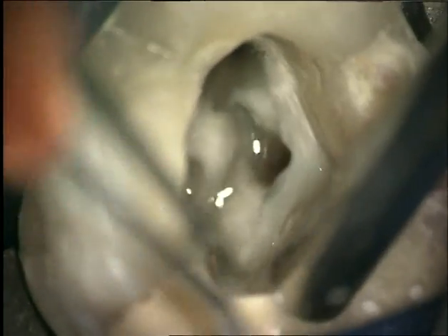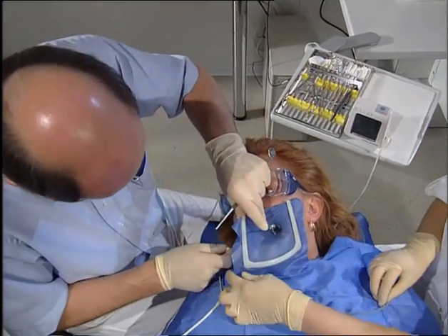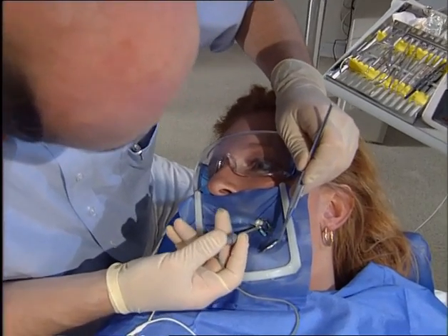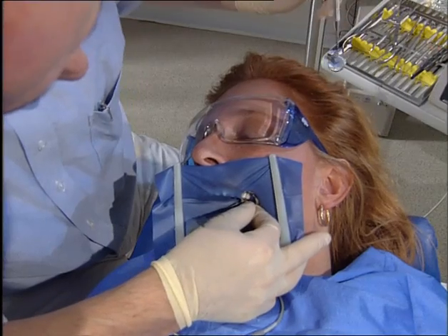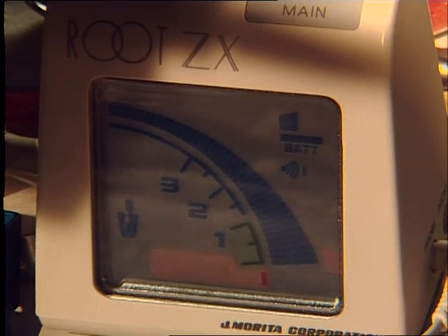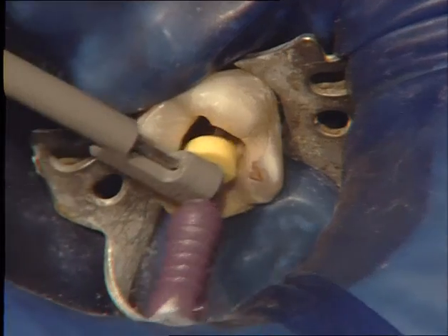The access cavity is gently irrigated with sodium hypochlorite. In order to avoid over-instrumentation, the length of the root canal instruments must be checked carefully. Modern apex locators measure the electrical impedance between the file and the mucosa. These devices provide accurate measurements to within 0.5 millimeters to the apex. The position of the root canal instrument is displayed on a screen, as well as acoustically.